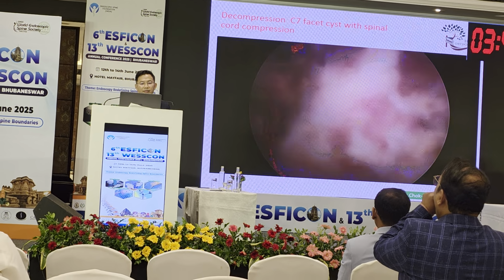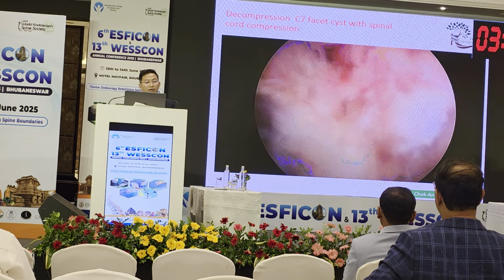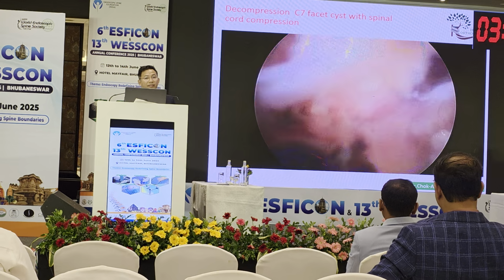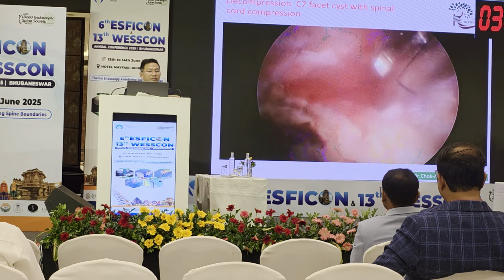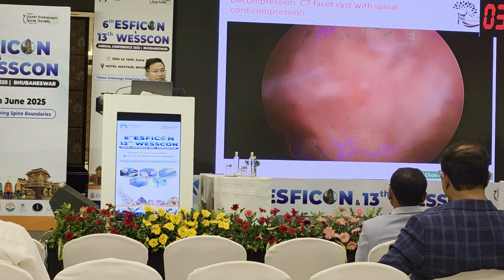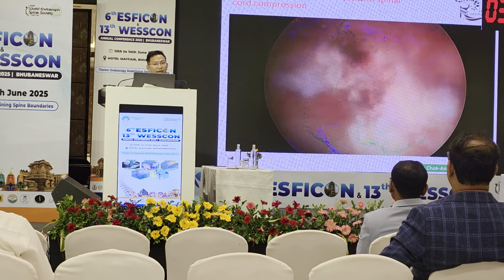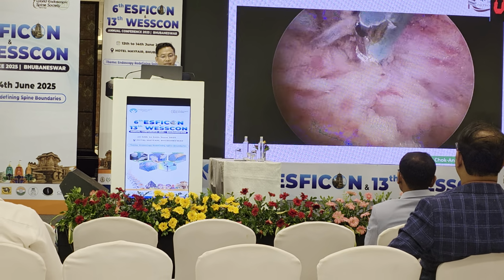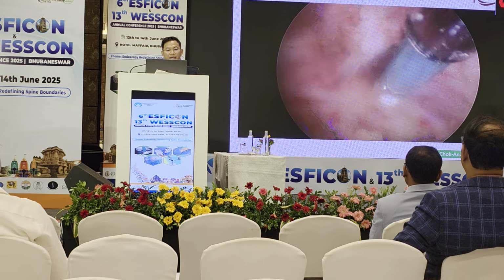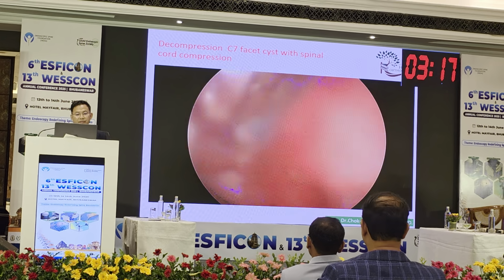After that, try to stop the bleeding. I recommend you use a pressure for the cervical of 30 to 40, not more than 40. When you do the bone work, you use 40. After finishing the bone work, you decrease to 30 to 35. It's better, and it can prevent increased intracranial pressure.